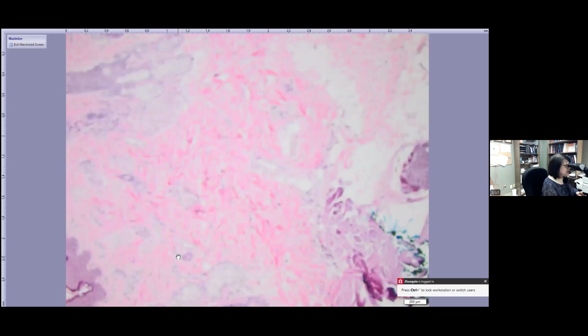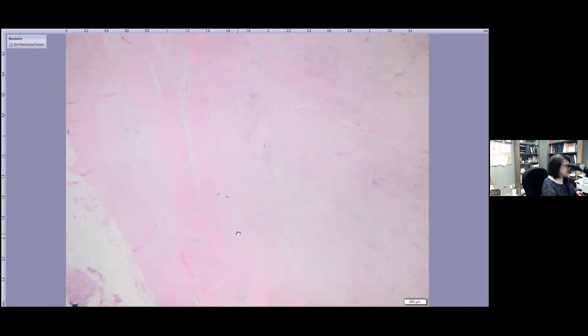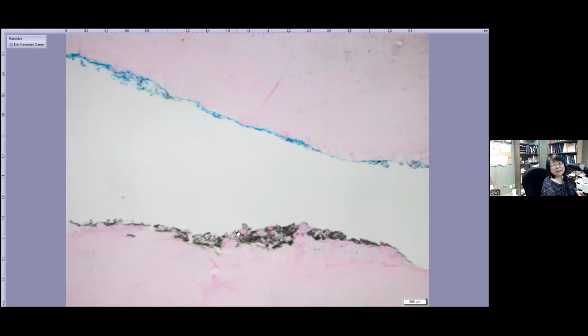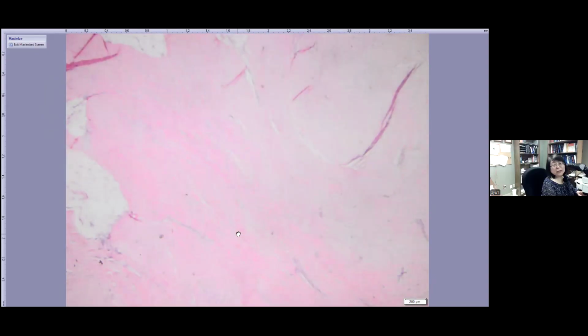That's normal collagen. Kind of like our Gardner fibroma. These are normal collagen here. But this, intermingled with this adnexal structure. This is our tumor. So it's kind of relatively circumscribed on the edge. But here, extended into the surrounding fat.